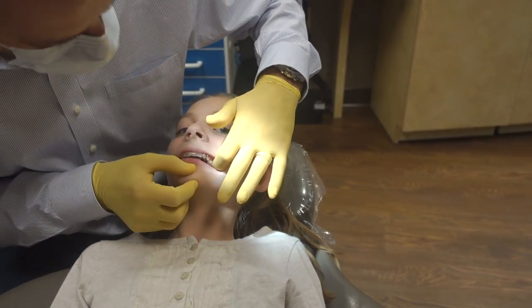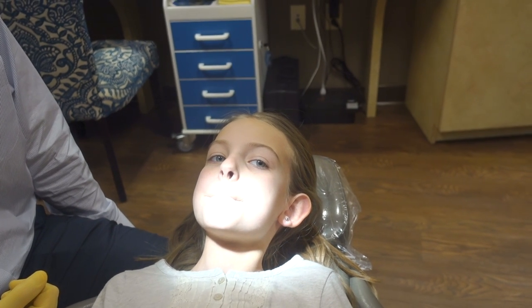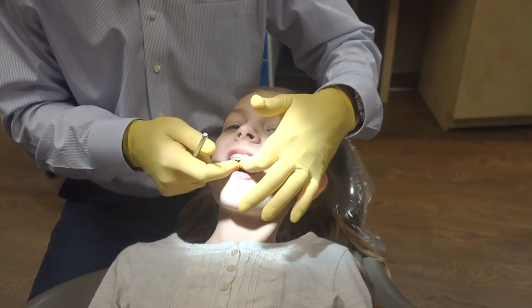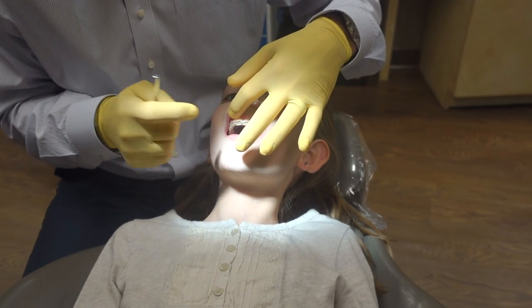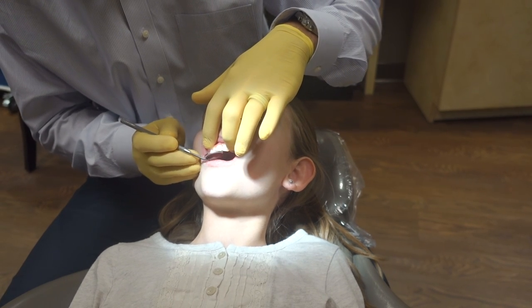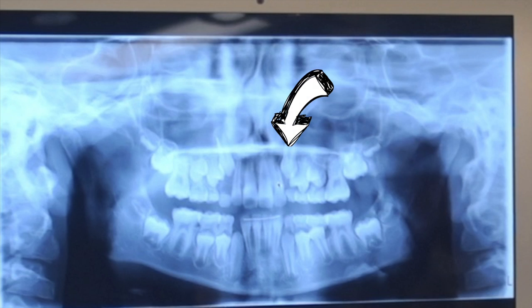Does it make any difference in your headaches whether you're wearing the retainer the night before? We just didn't know grinding was happening until you looked at the retainer and said she's grinding her teeth, and we went — maybe that's why she's always had headaches. Step one: in order to know where to add it and how much, we have to know where the retainer is going to sit. So let's try to make a real concerted effort to get this tooth to rotate back in. It's been a while since this retainer fit well — that tooth is at about a 45 degree angle and it was more straight across. So the sooner we can get this grouping of baby teeth out, the faster these three have to come down and recover.